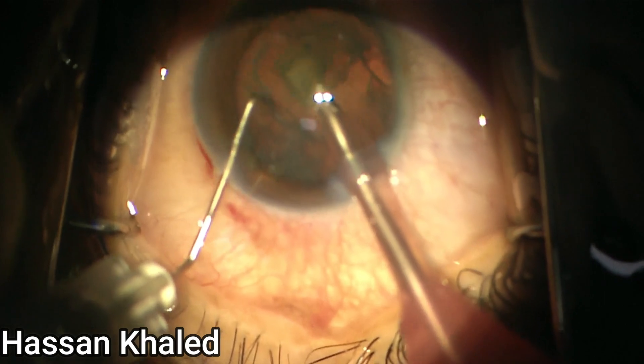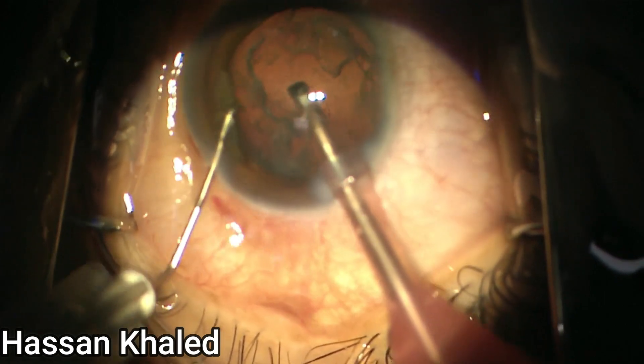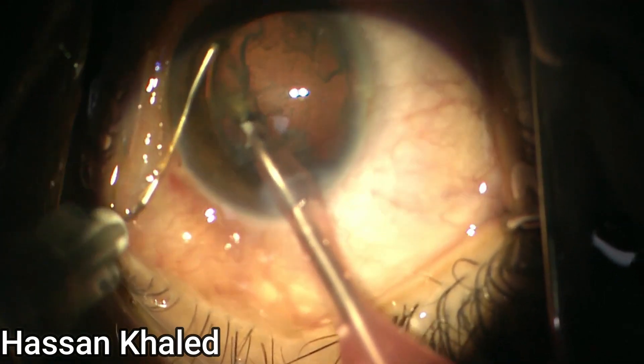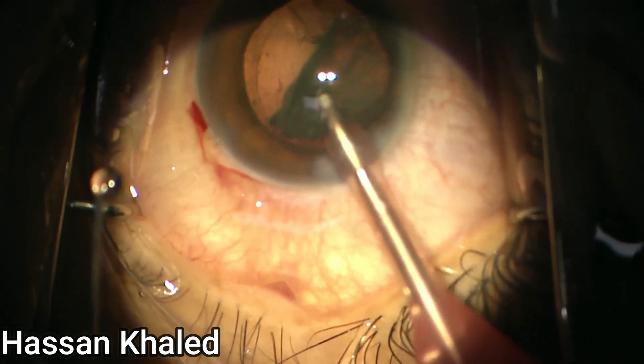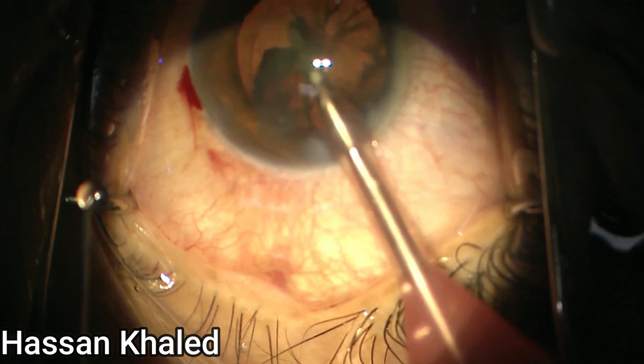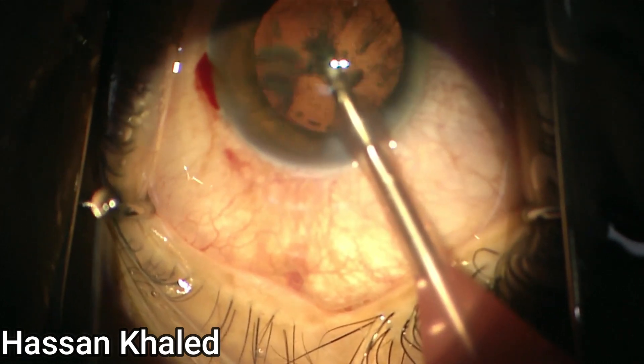Now the emulsification of this moderate dense cataract has been done properly. Everything went without any complications. Then you can just do aspiration for the epinucleus shell.